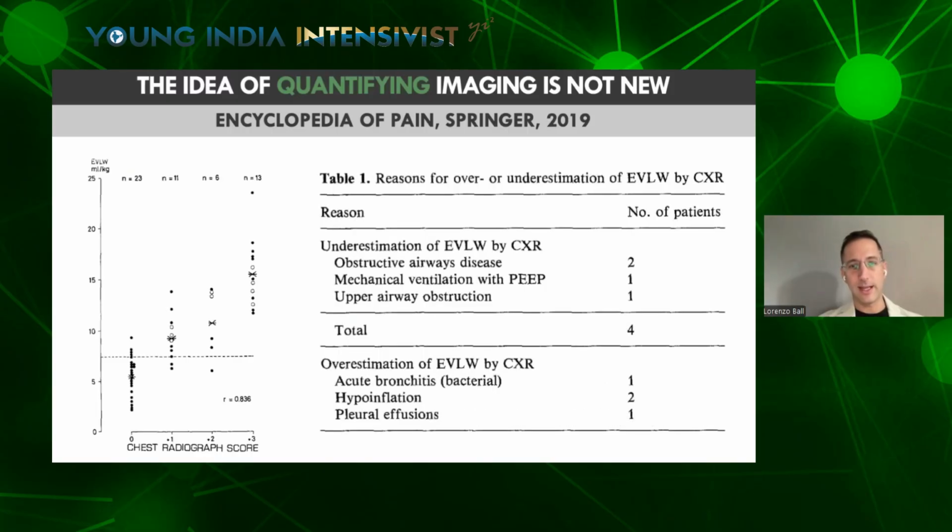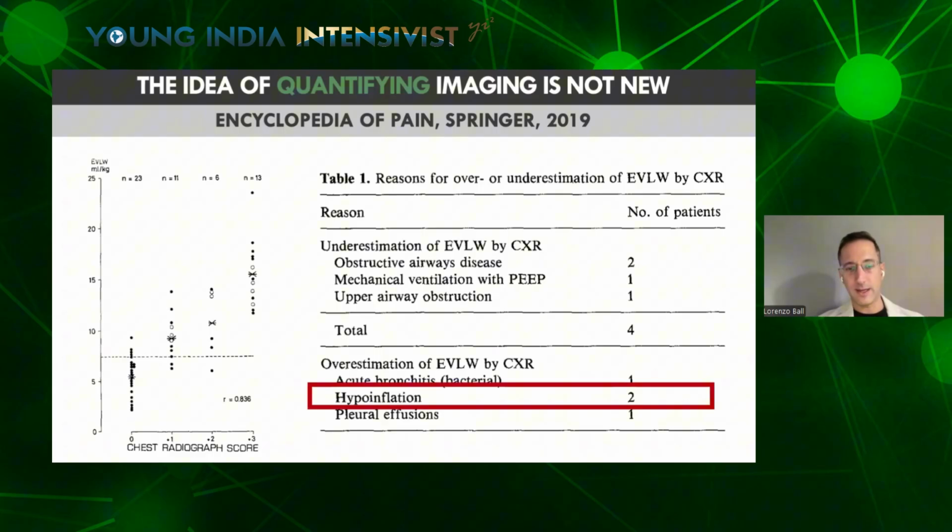What they saw in that study, apart from the nice correlation between extravascular lung water and the simple evaluation of chest X-ray, which is a very cheap technique that we still use nowadays, regardless of what we think about novel techniques, is that chest X-ray is still there. But we see in this very early report of attempting to quantify imaging that imaging and lung function are strictly correlated, because one of the factors increasing the chest radiographic score, of course, was hypoinflation. So atelectasis makes the lung more white and the score goes up.